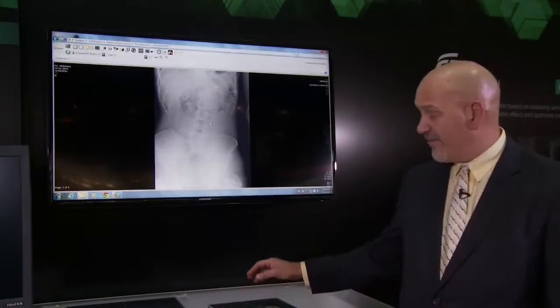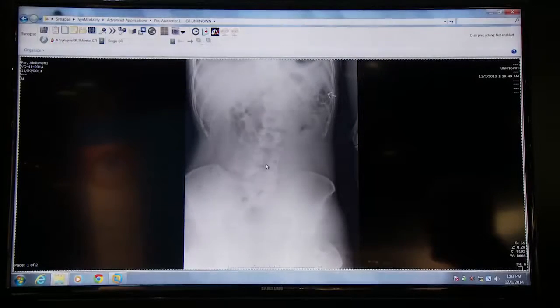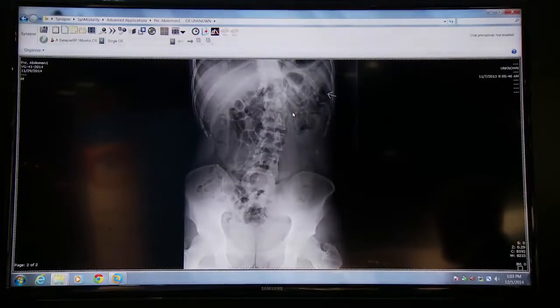Our new virtual grid algorithm will take this image acquired without a grid and process it as though it were acquired with a grid. As you can see, there is the virtual grid processing result of that image originally acquired without a grid.